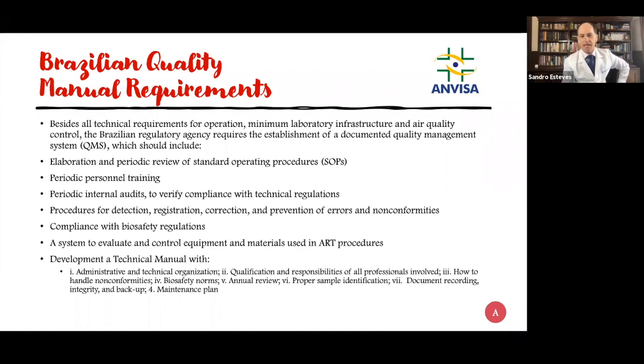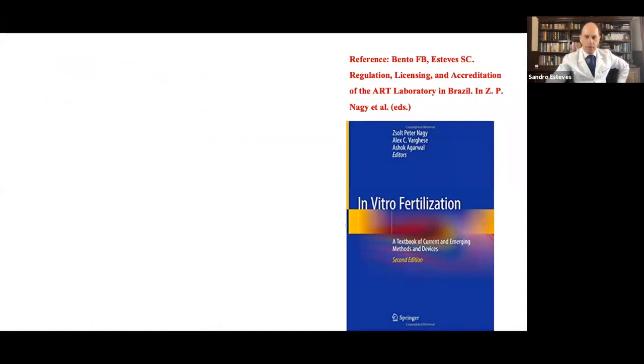They are not saying that the system has to be ISO 9001 or any other system, but the clinic needs to provide proof during the inspection, which occurs every year, that we actually comply with several QMS activities as listed in this slide. I will not go through in detail, but we need to comply with that.